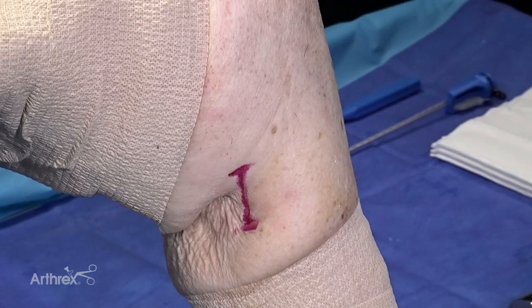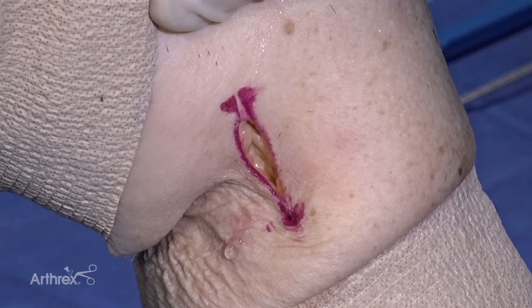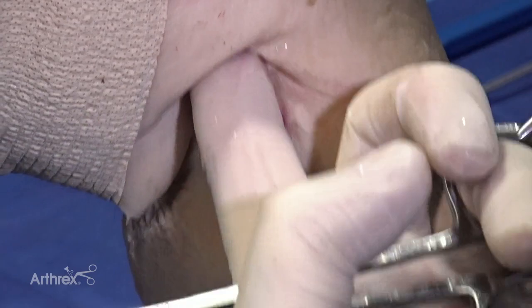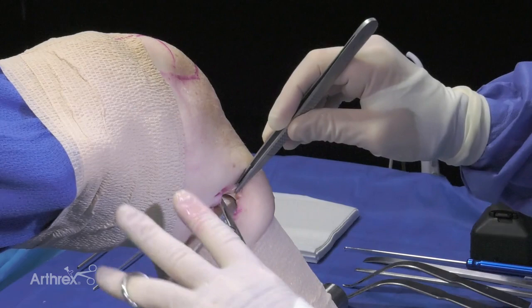So you know that we're going to have to be sort of under the pec, under the medial border of the deltoid to get access to the biceps tendon as it runs longitudinally up the arm. So a lot of this dissection can be done bluntly, just spreading gently. You'll come down on the biceps, short head and long head, and you get this confluence of the pec and the deltoid. And if you just pop through laterally, you can use your finger for blunt dissection, and that will allow you to get a pointed Homan lateral to the biceps around the humerus.